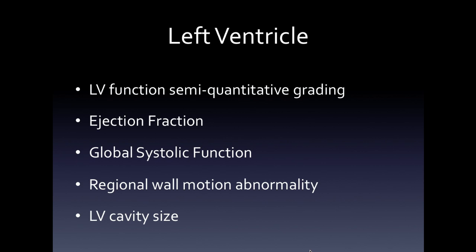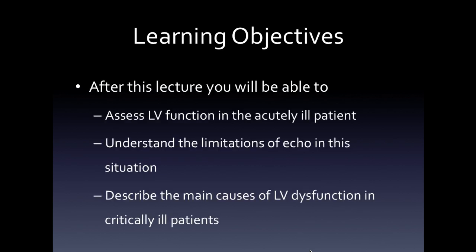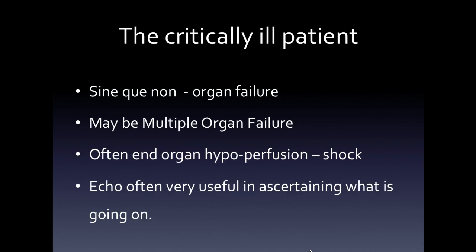In the interest of trying to make this more interactive and less cumbersome, we will touch on that, but maybe not go into huge detail. And I'm going to mention cavity size, because I think cavity size is terribly important. We're all going to have learning objectives nowadays, and after this lecture I'd hope you'll be able to assess LV function in the acutely ill patient. I think we'll all understand the limitations of echo even in the best hands, and then think in the clinical setting of the cause of LV function in the critically ill patient. As clinicians we come to it with an advantage, that we can try and pull all the bits together, so not just taking the echo in isolation.